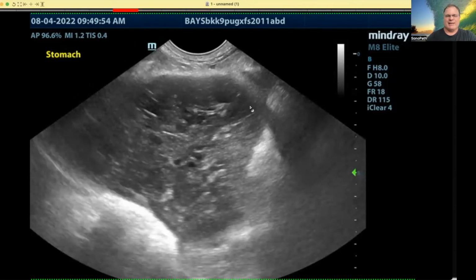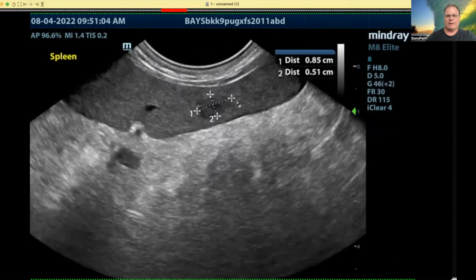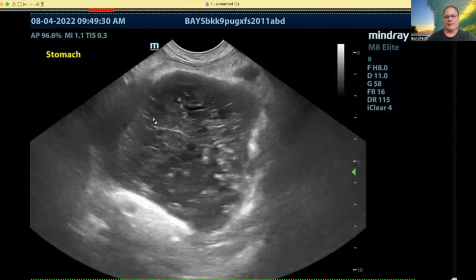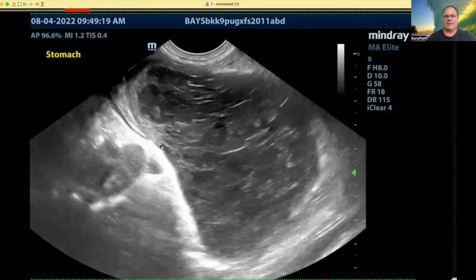But then in the area of the stomach, we have this big, ugly, hypoechoic thing. And you see all this reactive fat, and it's a cross between an elephant and a rhino. Elephino. And this is what we call elephino lesions. You really got to look at it. It's like, I don't know what that is. So we want to look at the video and see what this thing runs into and comes out of. And that's how we start to interpret it.